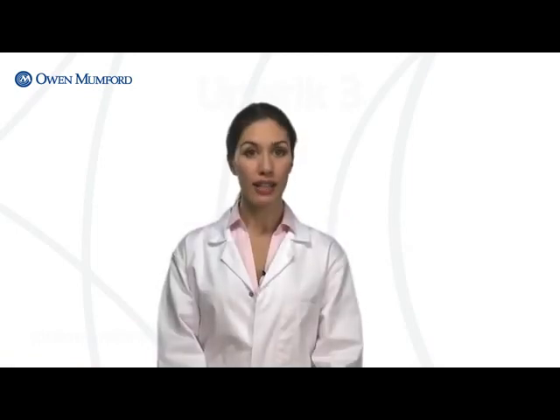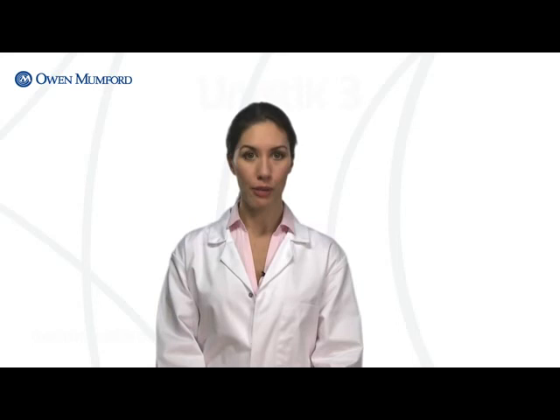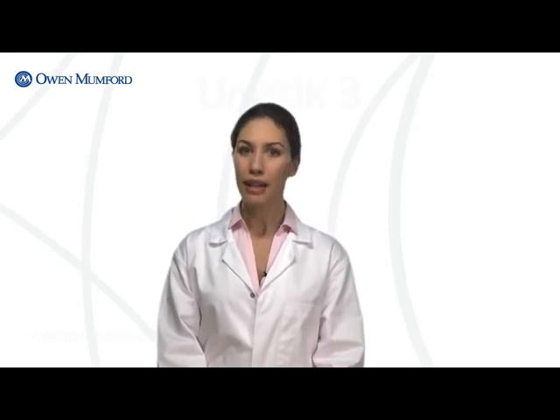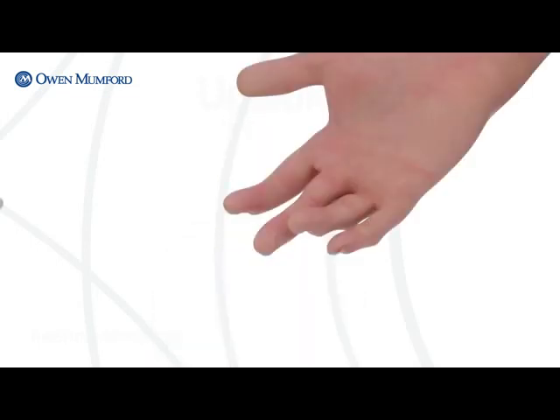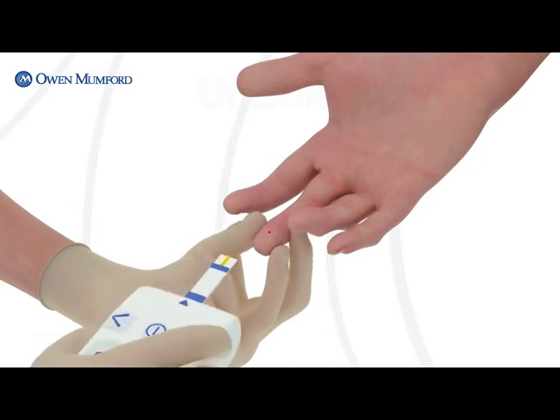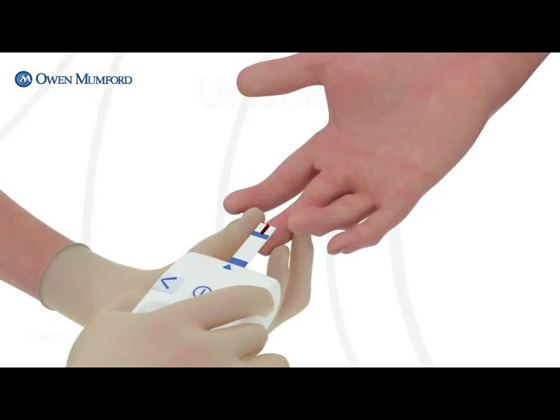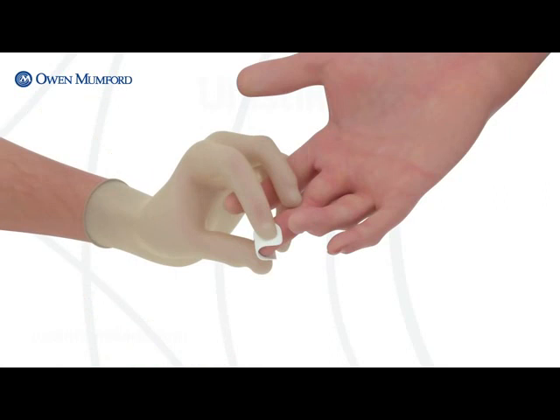For most testing, when collecting the blood specimen, the first drop of blood should be immediately wiped away with dry gauze. For low-flow point of care testing, such as glucose, this may not be necessary. Always refer to your institution's guidelines. You may apply gentle pressure to milk the puncture, but avoid excessive pressure or getting too close to the puncture site as contamination can result. Touch the collection end of the blood collection device to the drop of blood — blood should freely flow up the test strip or pipette, or to the bottom of a collection tube. Once you've collected the specimen, handle in accordance with the appropriate guidelines. Be sure to apply direct pressure to the sampling site. Follow with a bandage if necessary.